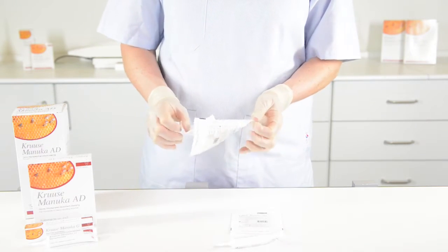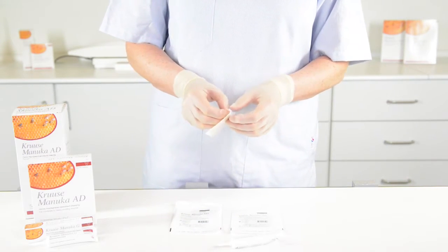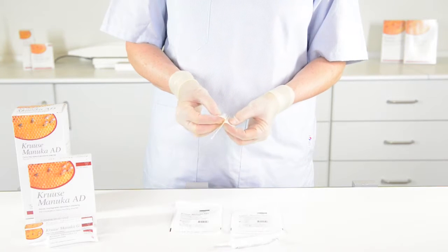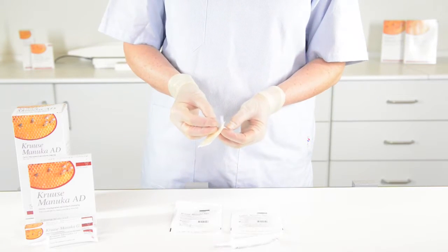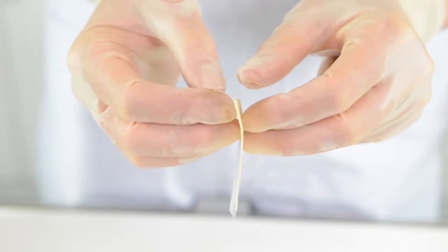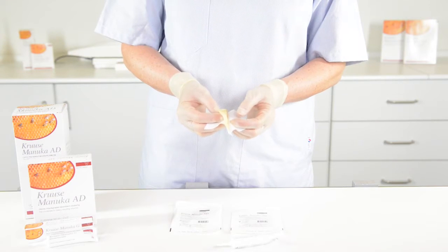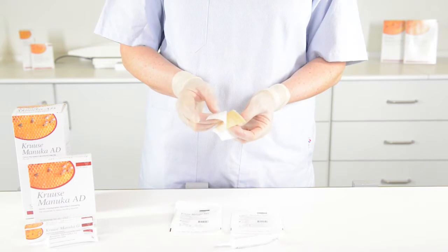You open it and you see that the product is covered by two layers of paper. Inside there is an acetate gauze which is impregnated with 100% Manuka honey.